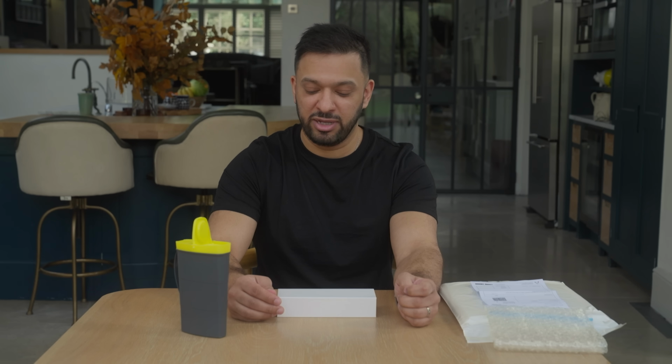Mounjaro is a weekly injection, and each pen will contain 4 doses. Therefore, each pen is designed to last for 1 month. Mounjaro is available in 6 different strengths, and each pen is colour coordinated. The strengths available are 2.5, 5, 7.5, 10, 12.5 and 15 milligrams.